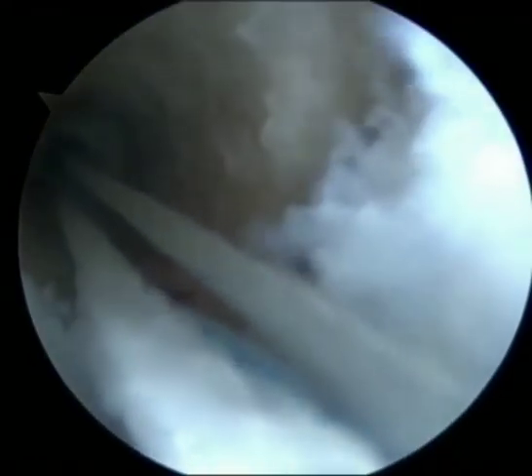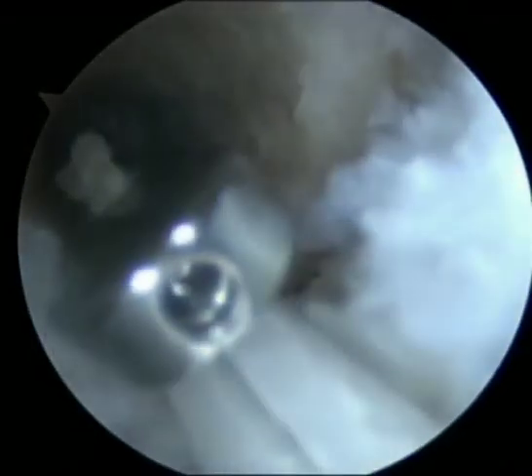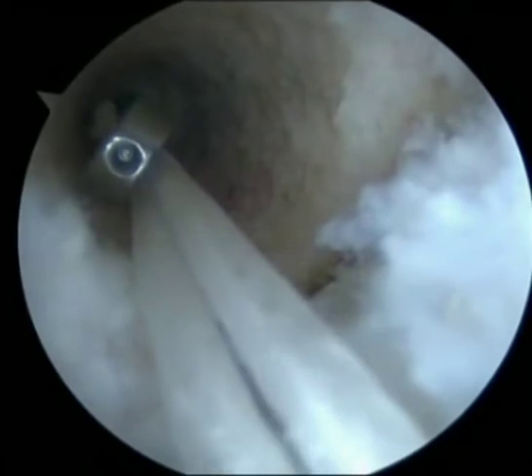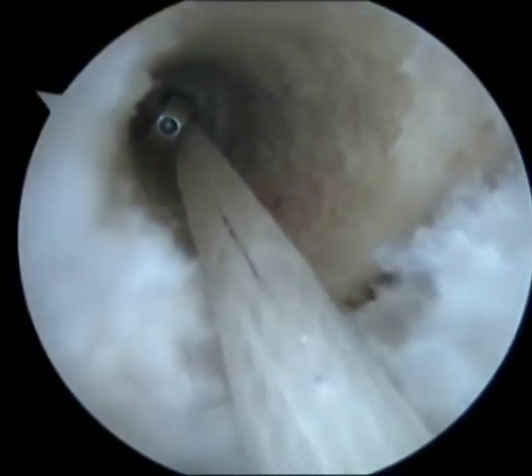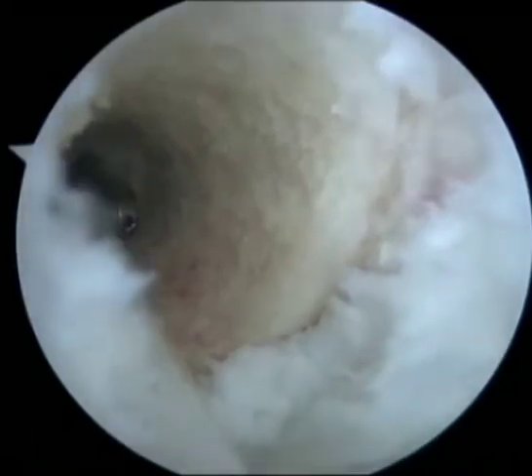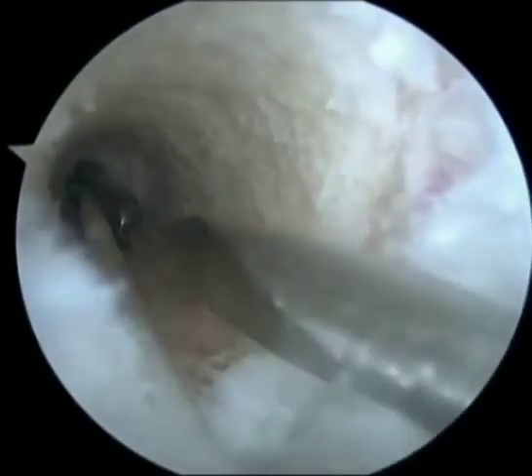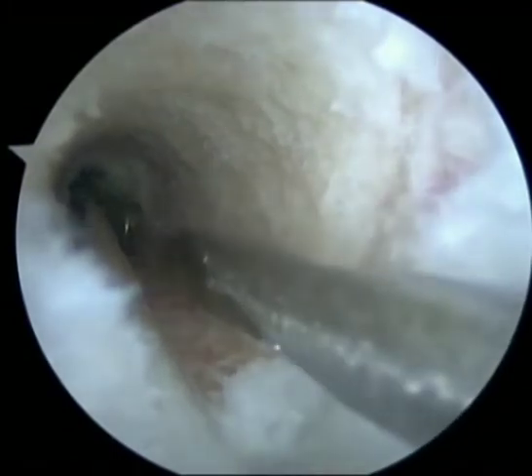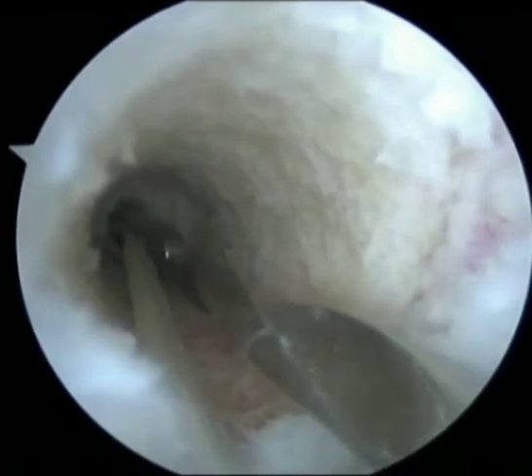The sutures are pulled till the button reaches the guide pin hole and a resistance is felt. At this point, under arthroscopic vision, a 2.4 mm guide pin is inserted through the anteromedial portal and negotiated against the depression which is present on the end of the button facing the socket.